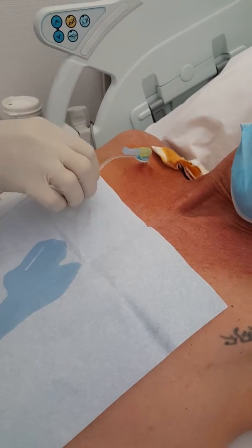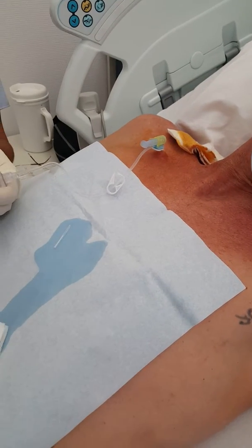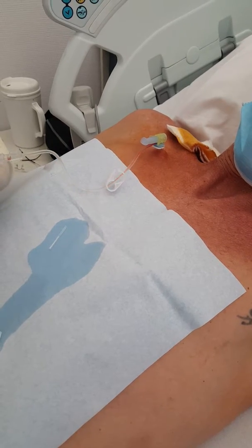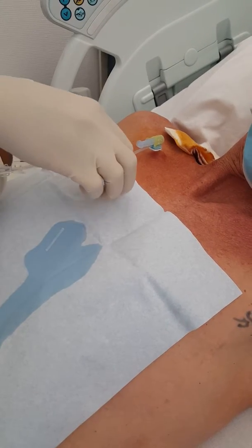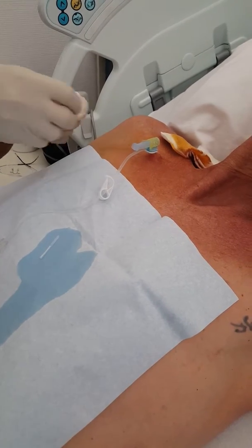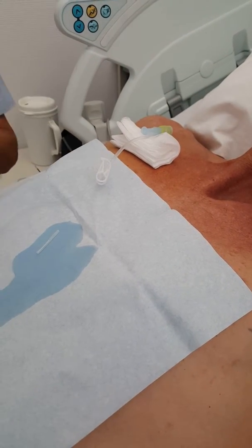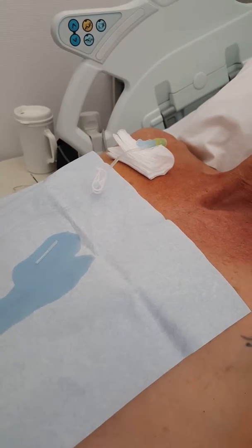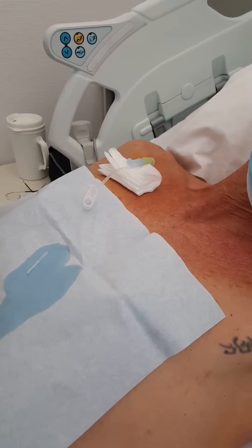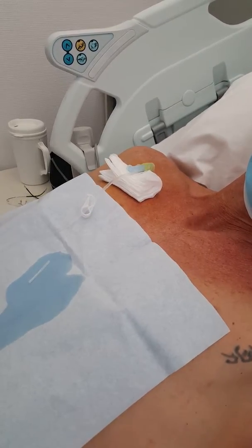It burns a little bit, but that's only because there's a disinfectant that she uses before, so a little bit goes into the vein. And then we'll begin with the first pochette — they speak of hydration, which will be just water, just to fill my body with liquid.